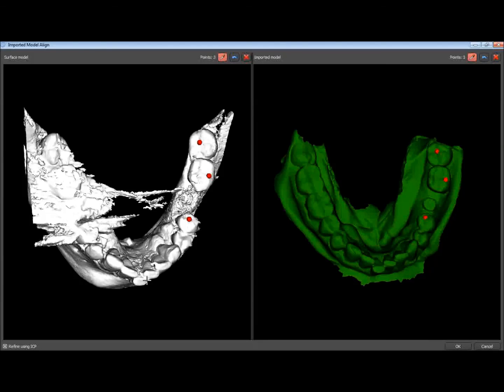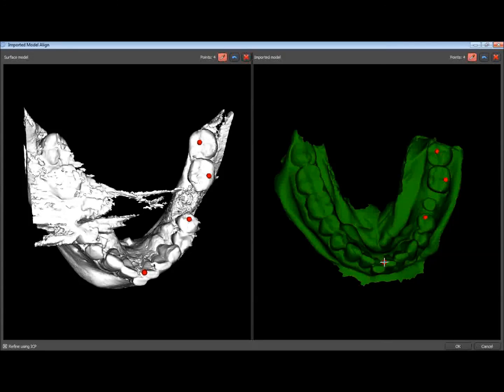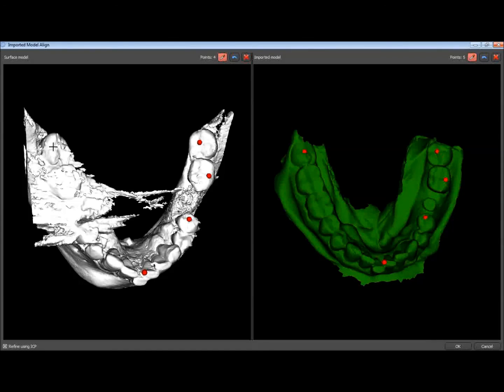I'm going to go ahead and pick this point right here as well. And this looks like a good area right on the incisal edge at the corner here. That's four points so far. Pick this groove right here. And right here on the third molar back there.